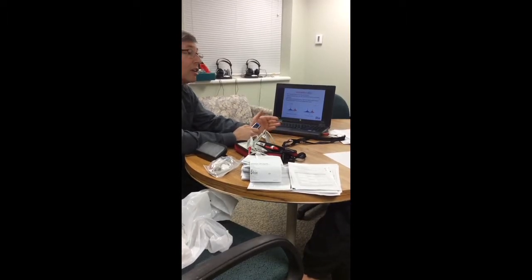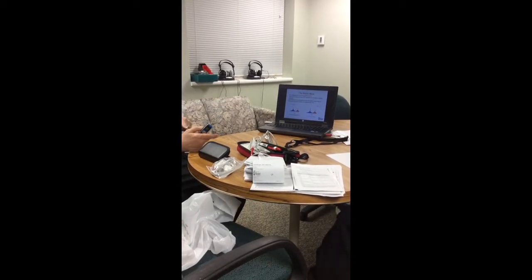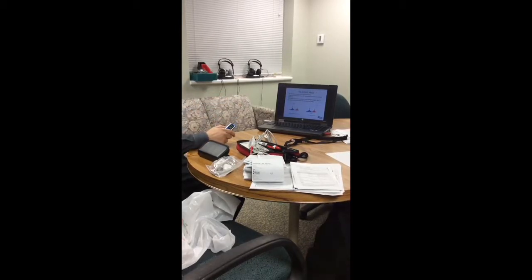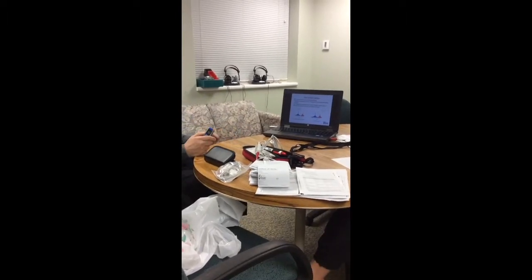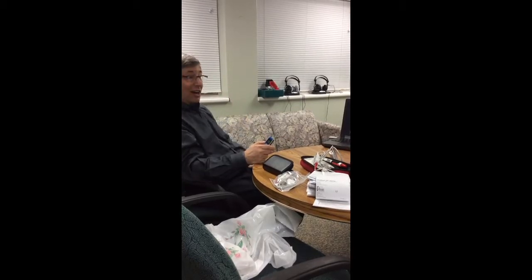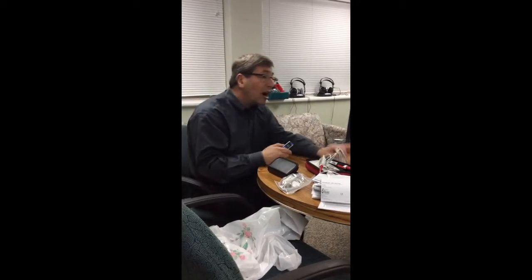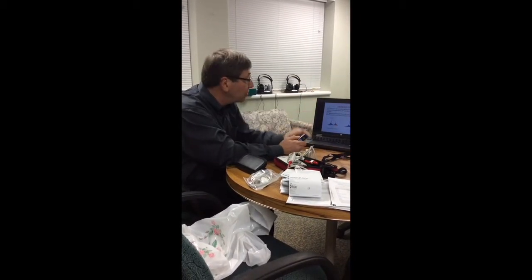We all agree that arterial pulsing is what we're using to measure pulse oximetry, but in that whole thing, we've got venous return, we've got shaking, we've got low perfusion. And because of that, just like with ECG monitors, if the size is set way too low, we pick up artifact, we pick up PVCs, and so the actual heart rate's 60, but the monitor's saying 100. We always want to treat the patient, not the monitor. The problem with that is, what's the true heart rate? Now, you will get the true heart rate off a pulse ox because every time you contract, it's going to read that, versus an electrical, which could have interference.